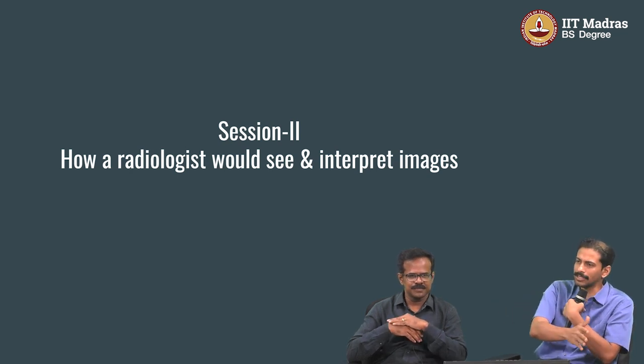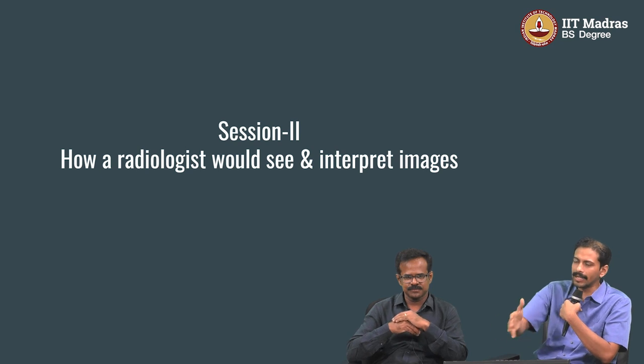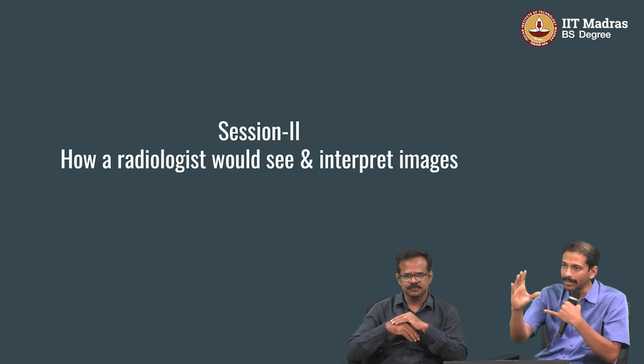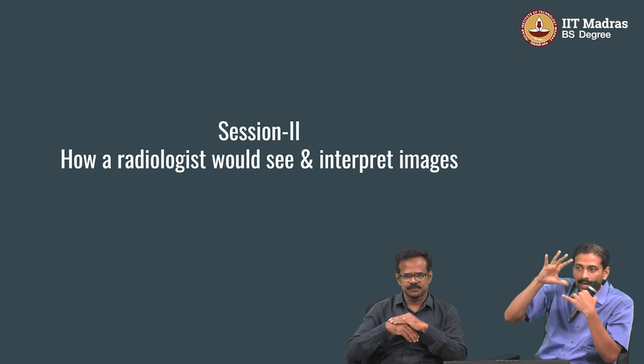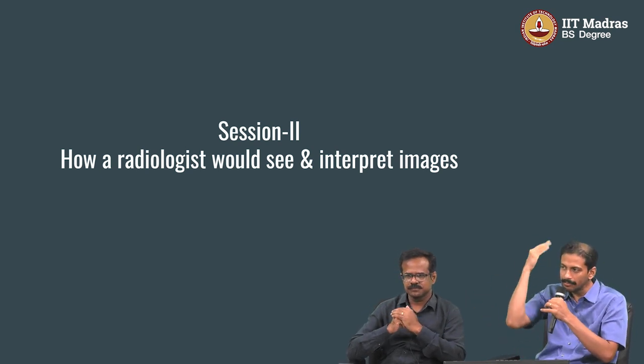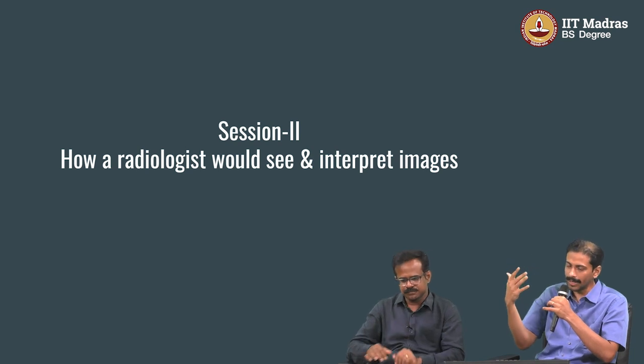Starting from choosing the patient, workflow, automating the sequence. In MR, as I said, we can do multiple paradigms. Do a T1 weighted sequence. That's the reason why MR takes a longer time to finish. You don't take a single volume. You acquire one volume with something in mind, a second volume with T2 characteristic in mind, a third volume with a different characteristic in mind. So you take multiple volumes, right?